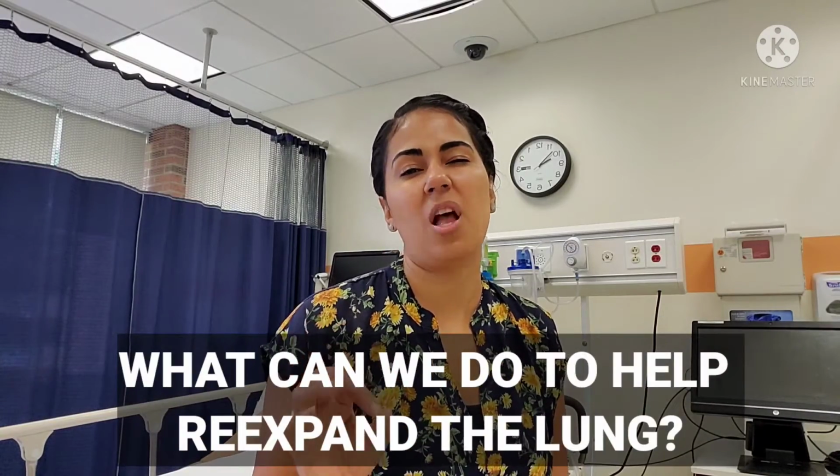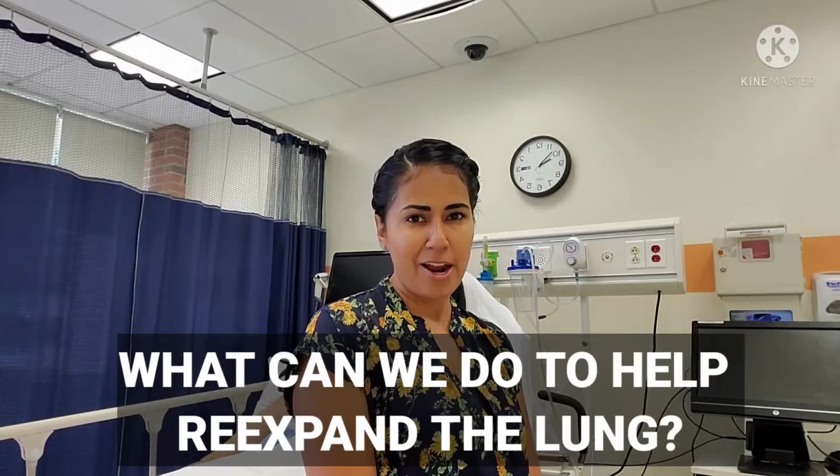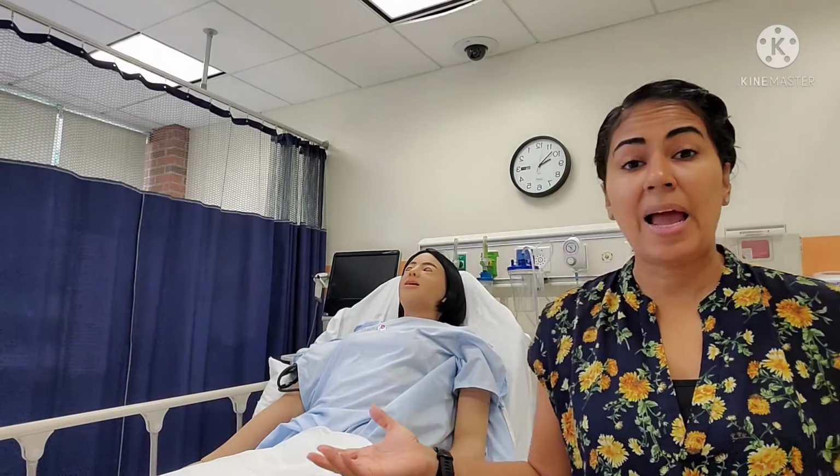Now what we should talk about is how we are going to assist this patient to re-expand the lungs. Besides the chest tube, there are other things that we should do. We talked about pain management. What else can we do to help this lung re-expand? All right, so hopefully you said sit the patient up. Now, if the patient is hemodynamically stable, this patient should be in a chair. They should not be lying down.